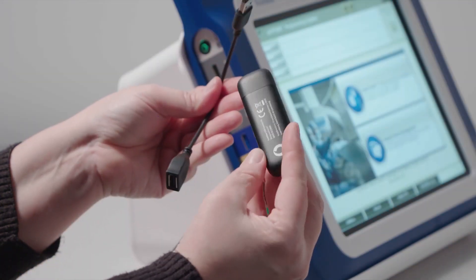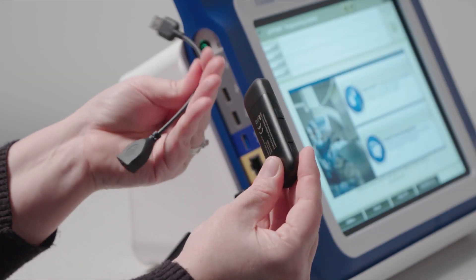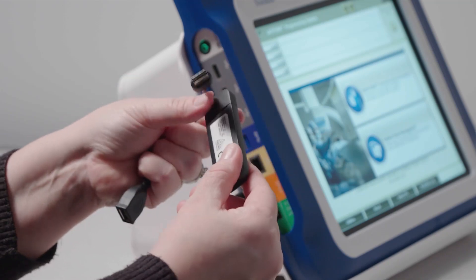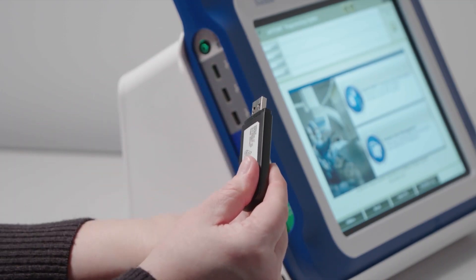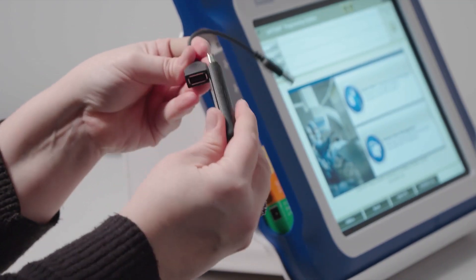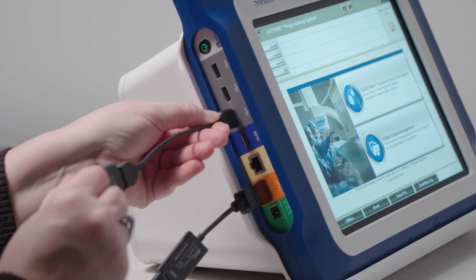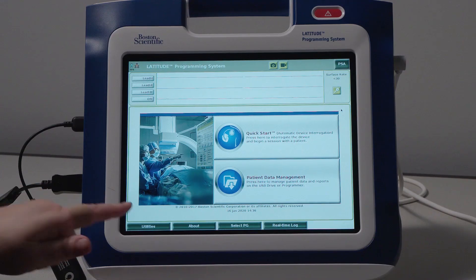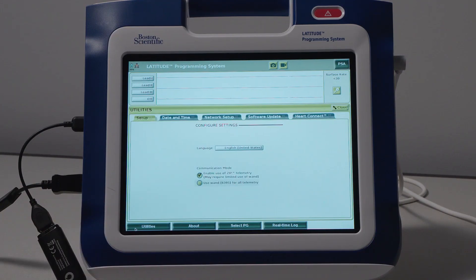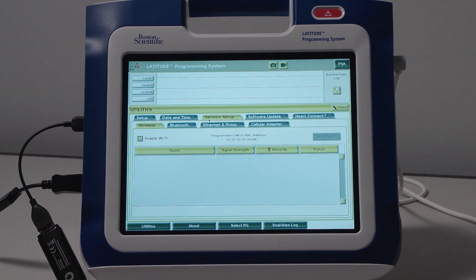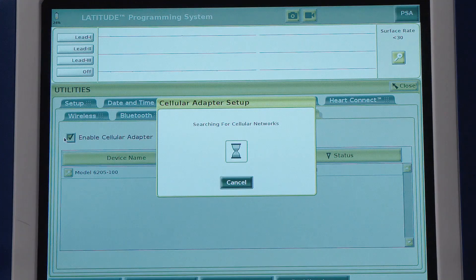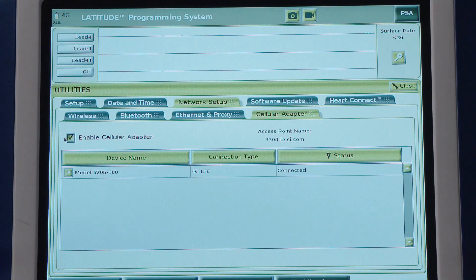The last connectivity option is the Model 6205 cellular adapter, which can be ordered by contacting your Boston Scientific representative. Attach the adapter to the cellular cable, and then connect the cable into a USB port on the programmer. Navigate to Utilities, Network Setup, and then select the Cellular Adapter tab. Click the Enable Cellular Adapter checkbox. The programmer will search for the Model 6205 cellular adapter. Once found, it will connect and status will reflect the connection.